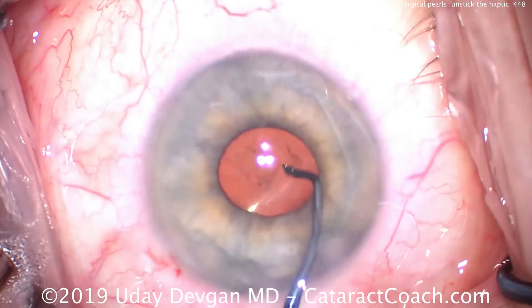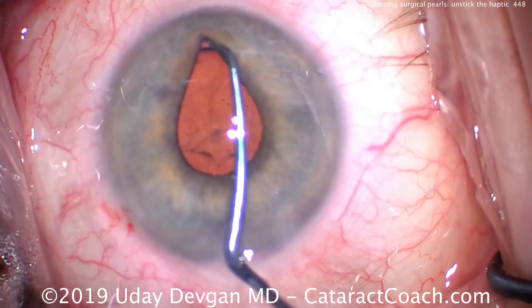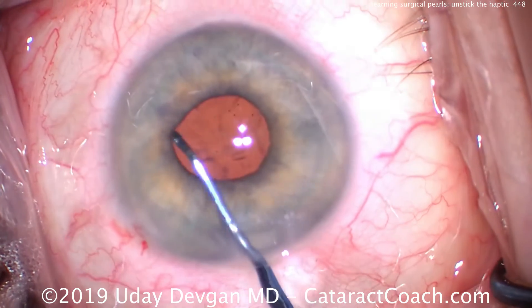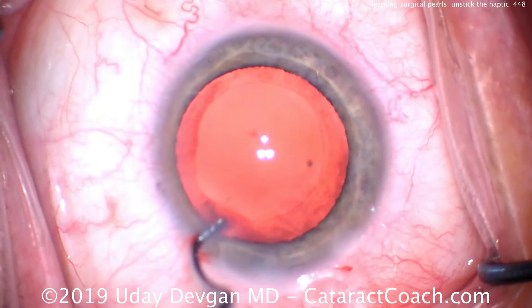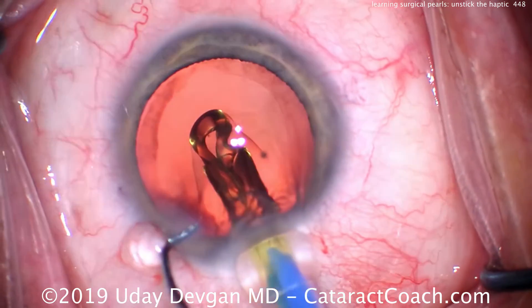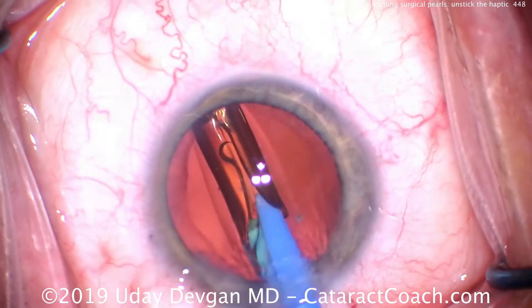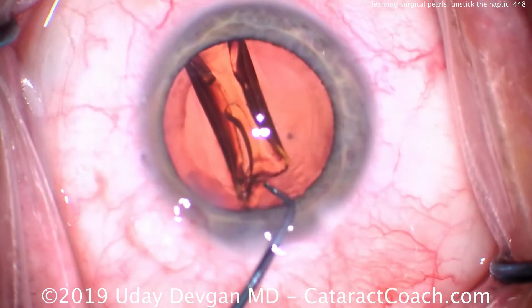Viscoelastic is placed into the injector, which helps lubricate the entire process and also prevents the optic from sticking onto and holding onto the haptics. So everything looks great there. Here's a case where there's a little bit more of a challenge — again a routine case, putting the lens in the eye at the end of the case, delivering in the capsular bag with the same injector and the same type of system.